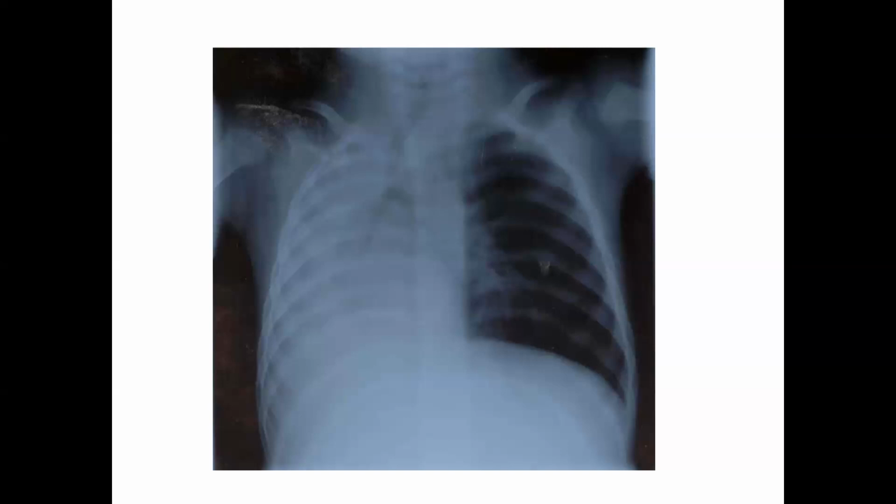The other safety mechanism I will mention is with an MRI machine, it's a super strong magnet. So you want to make sure that you're not taking anything metal or anything that would be attracted to that magnet inside of that room, because the magnet could grab it and hold on. And if you care to look on YouTube, there are other videos on the attraction of the magnet for an MRI machine, it's pretty hardcore.